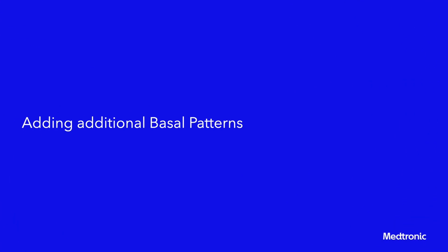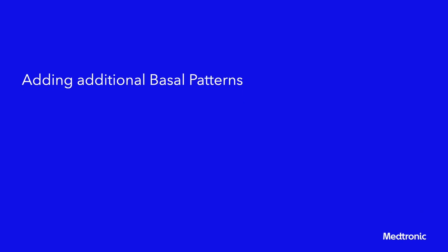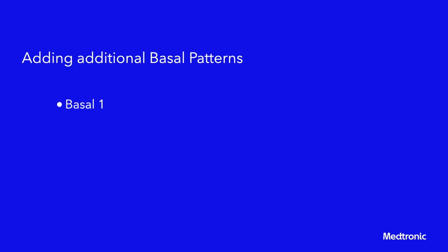Adding an additional basal pattern. Here we will show you how to add a new basal pattern after at least one basal pattern has been set. The following basal patterns can be set up: Basal 1, Basal 2, Work Day, Day Off, Sick Day.